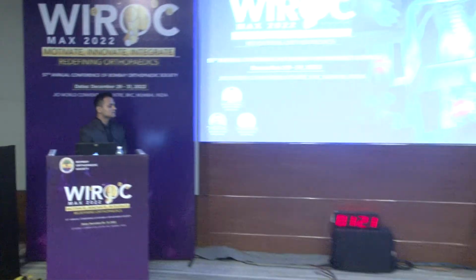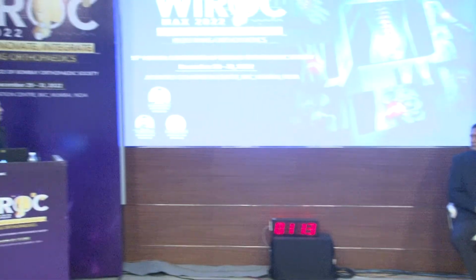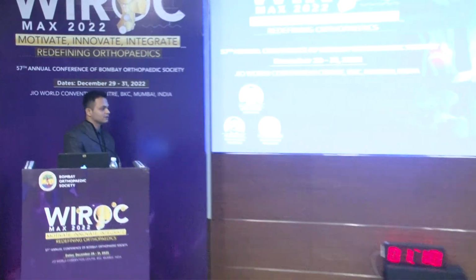What about comminuted? You mentioned only the transverse fracture. No, what about comminuted? 3-4C includes transverse as well as comminuted. Yes, comminuted also, C1, C2, we recommend this for all. So that round cerclage is for containment of all the comminuted fragments.